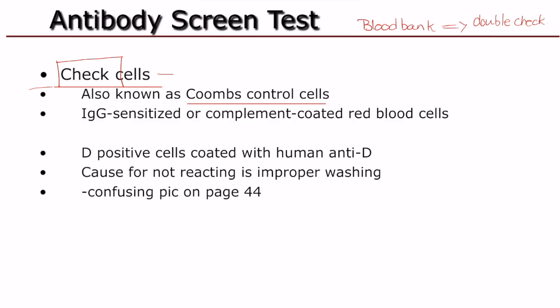This is really a very old term, and I've even heard individuals, when we talk about the anti-human globulin, or AHG, call this Coombs reagent.